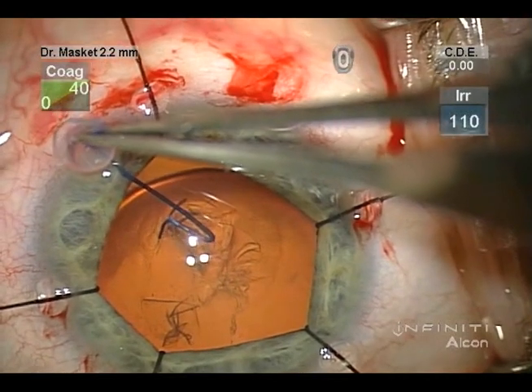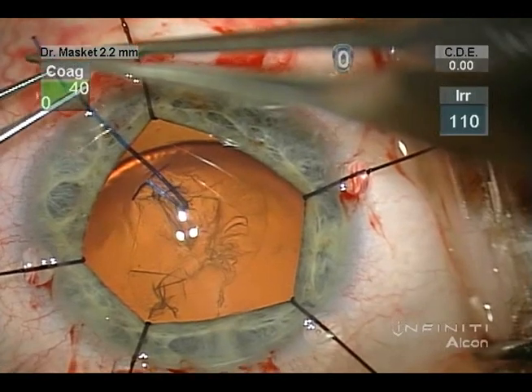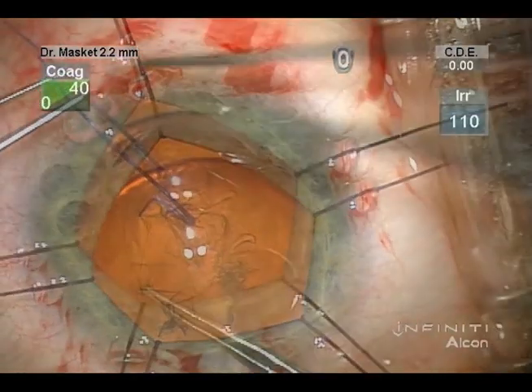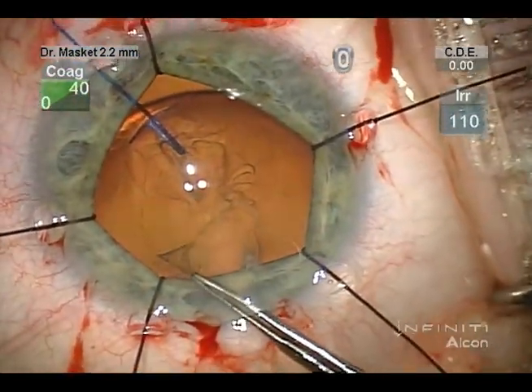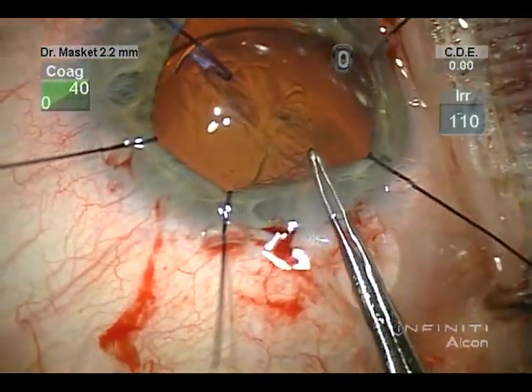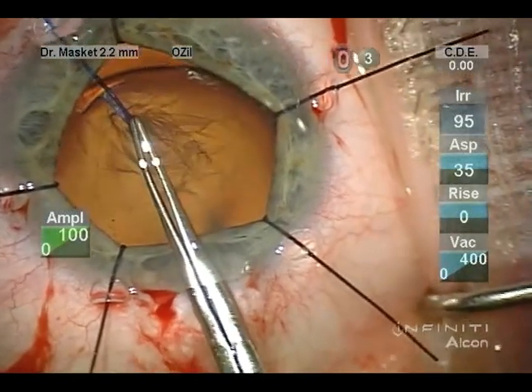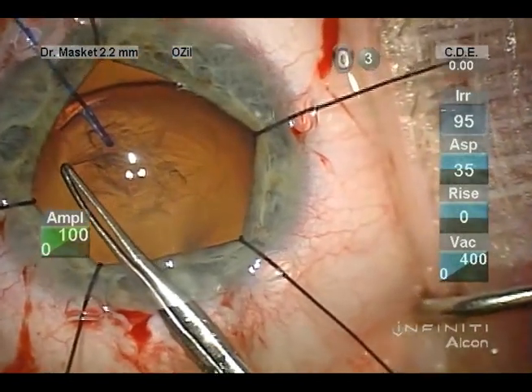So in this situation, a Yaguchi-Kazawa capsule support hook is passed beneath the anterior capsule in an attempt to bring the lens into a more orthotopic position and to provide some traction for the capsulotomy, which is then completed.